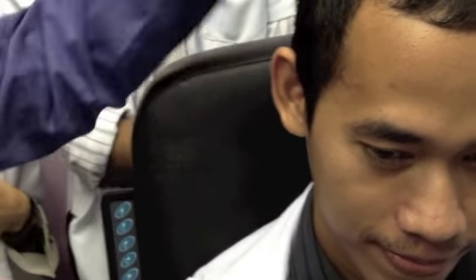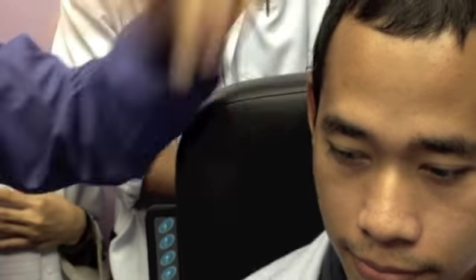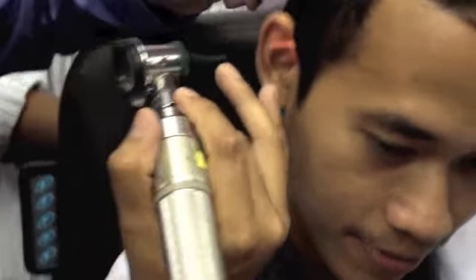It goes through. Alright. Again, style, quality and excellence. How you act. You know, you just... I want to examine the ear. Okay, then you go in like that. I give you 5 marks only. The thing you're supposed to see, then you have to describe, then you like it.